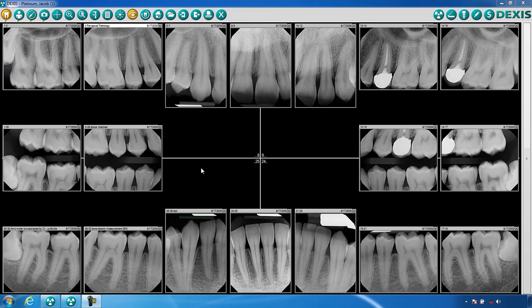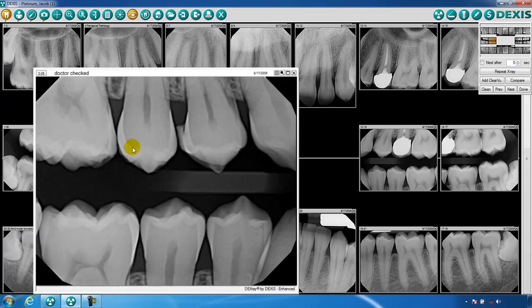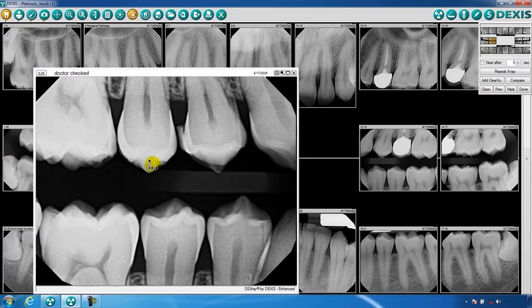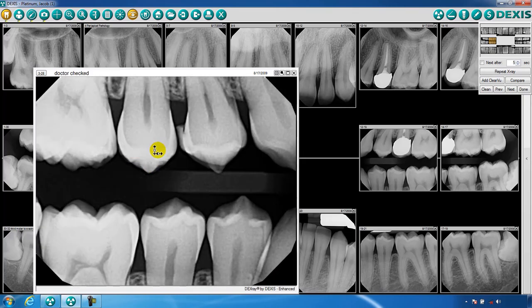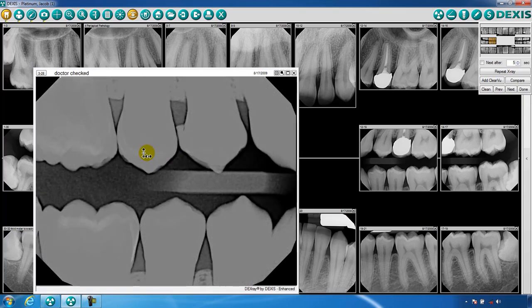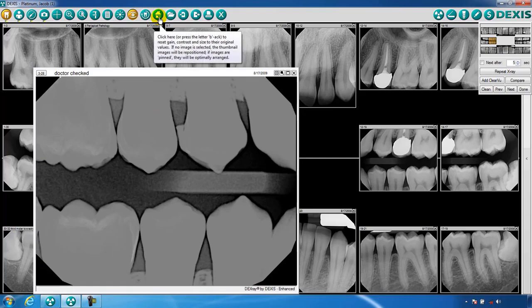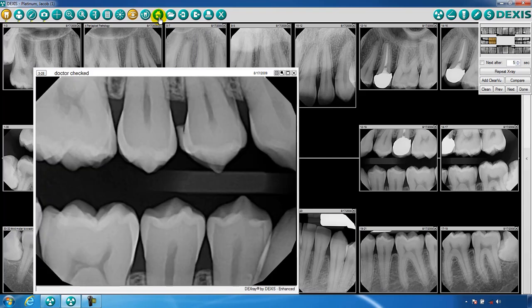Enlarging an image is performed by selecting an image and clicking again to enlarge it. While viewing an enlarged image, you may change the brightness and contrast by clicking with your left mouse and dragging up and down the image for brightness, and left and right for contrast. When you change an image in this fashion, you will always be able to return to the original image by clicking on the house icon on the toolbar, or by pressing the B key on your keyboard.